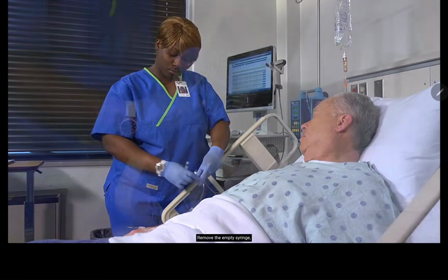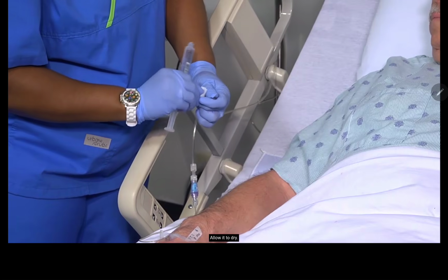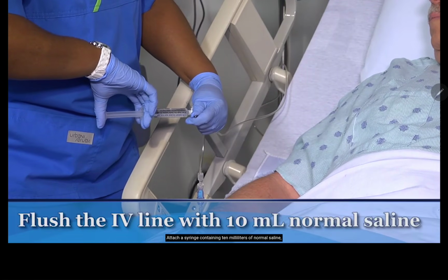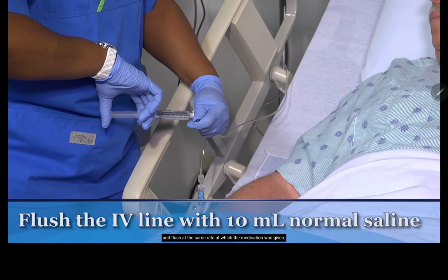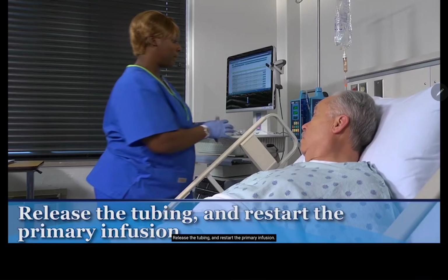Remove the empty syringe and re-clean the port with an alcohol swab. Allow it to dry. Attach a syringe containing 10 milliliters of normal saline and flush at the same rate at which the medication was given. Release the tubing and restart the primary infusion.